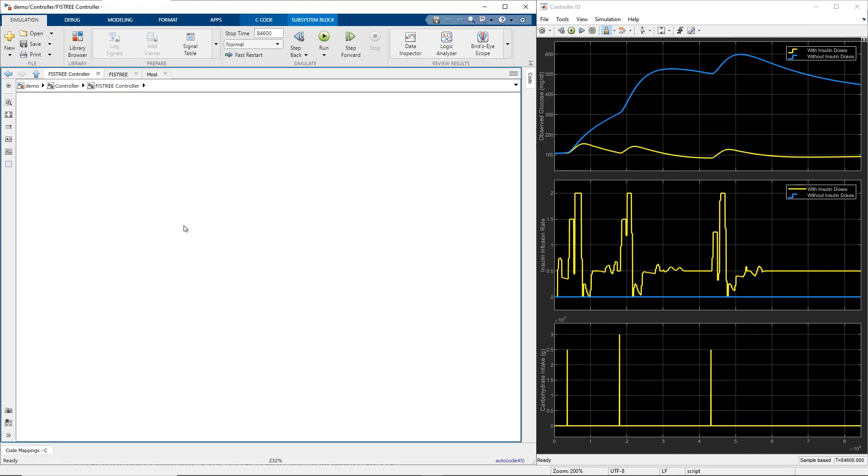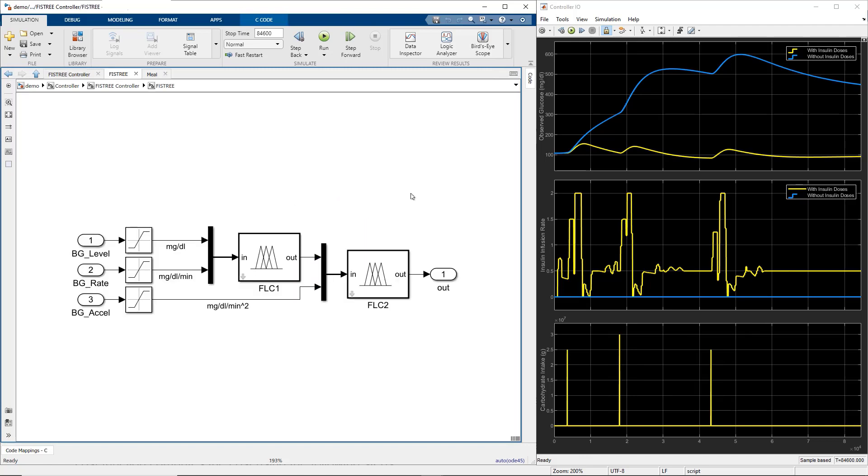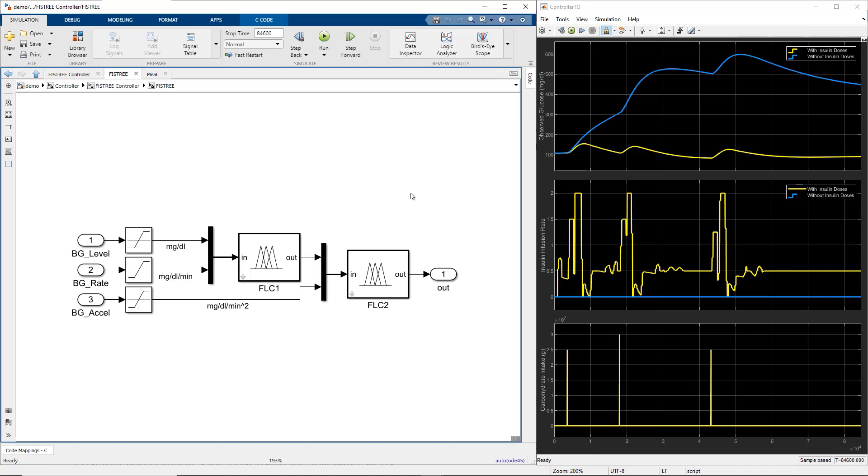The fuzzy controller is enabled every 5 minutes with a new sample. It uses three inputs: blood glucose level, its change rate, and acceleration rate. The controller uses a tree of two connected fuzzy inference systems to incrementally add the inputs and fuzzy rules. It also reduces the total number of rules.